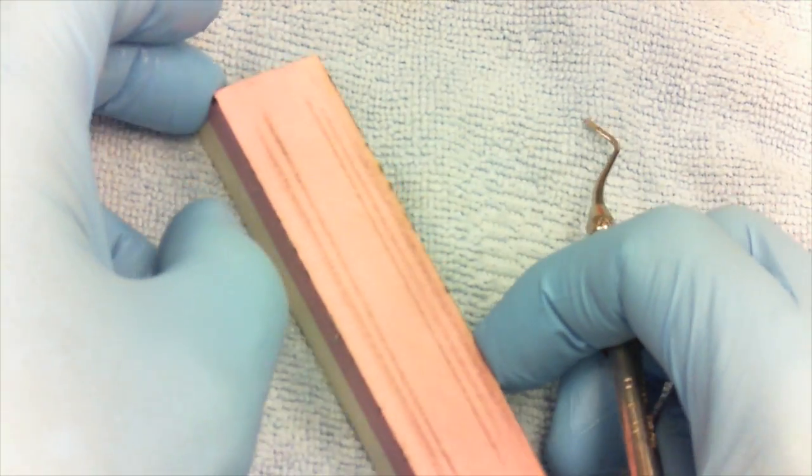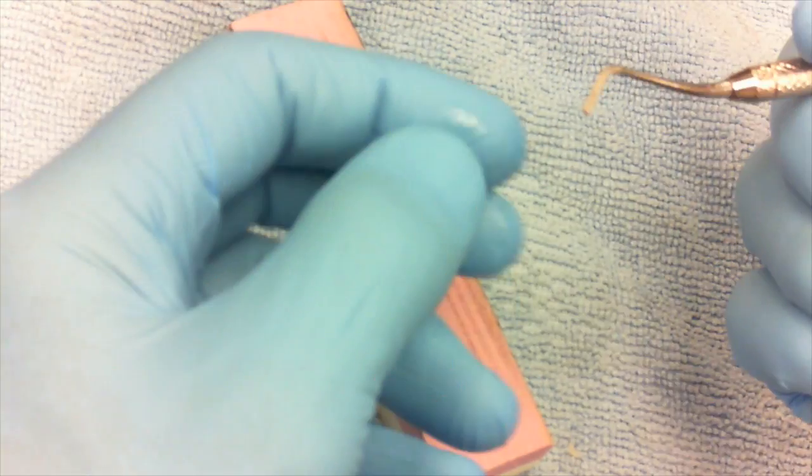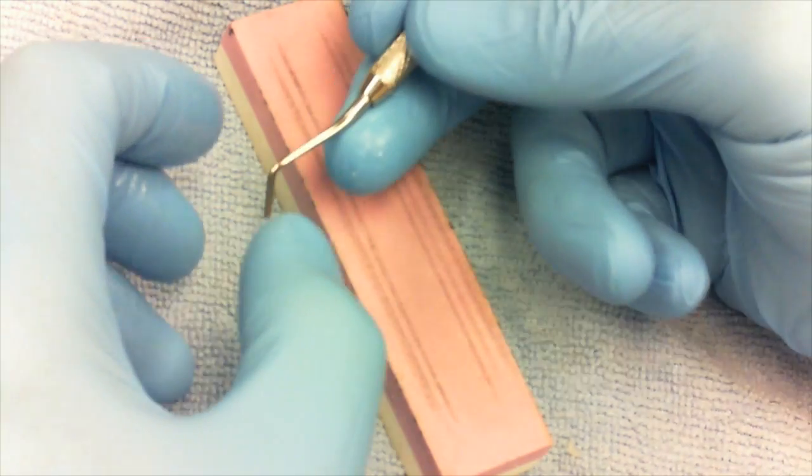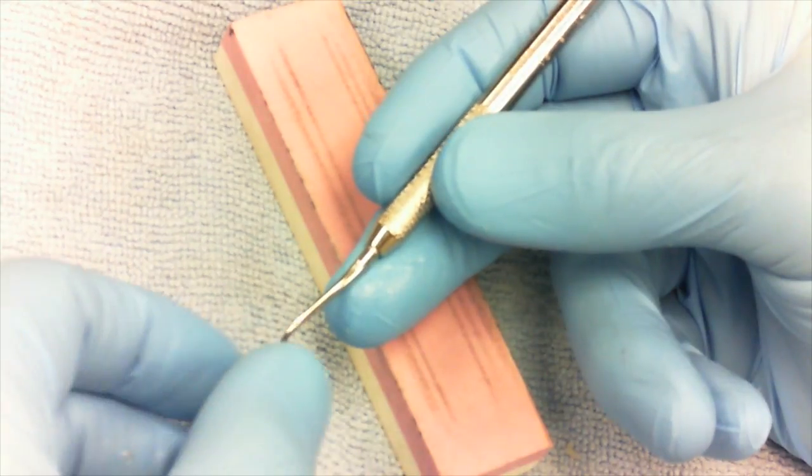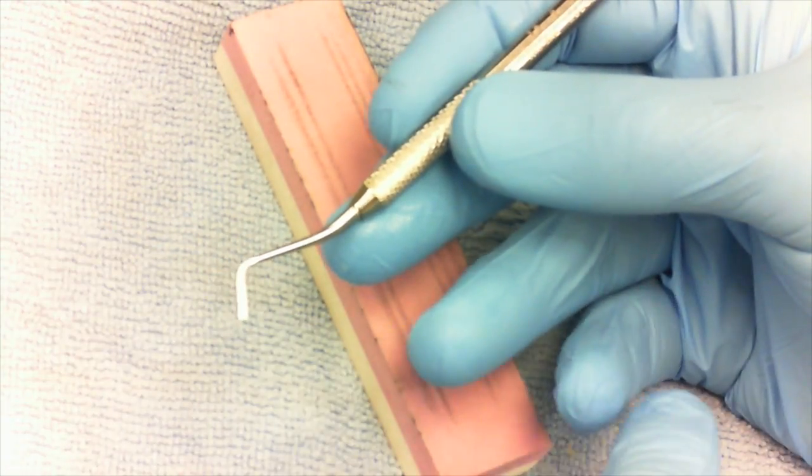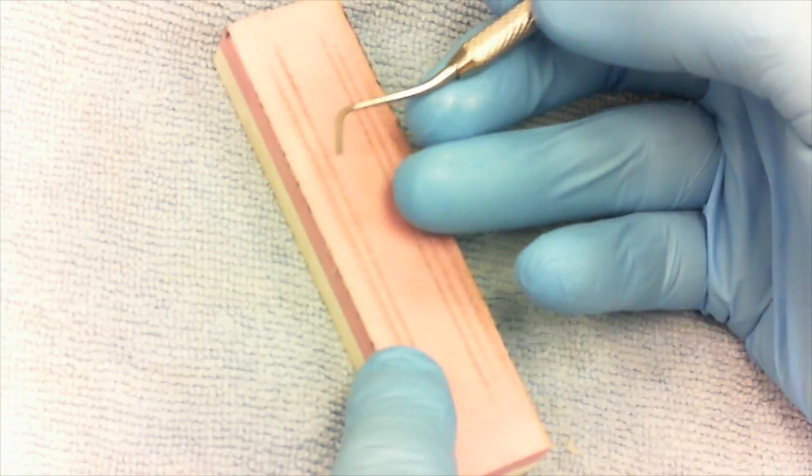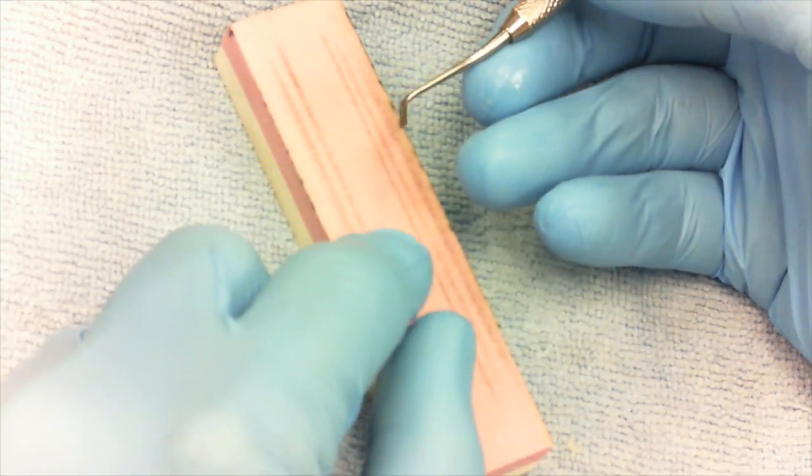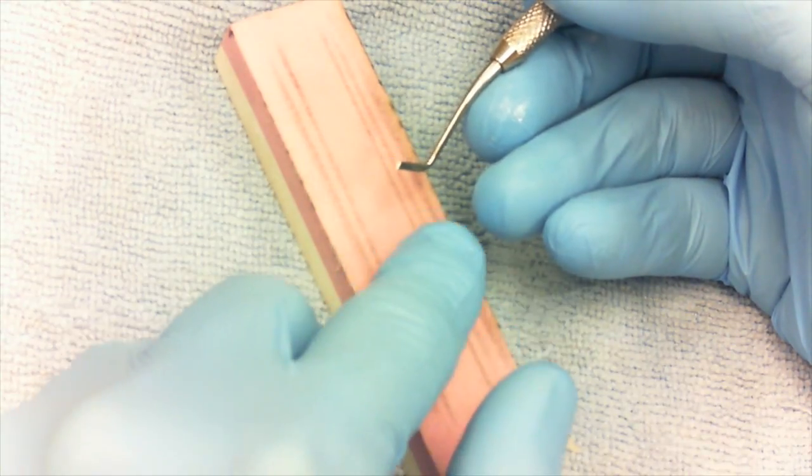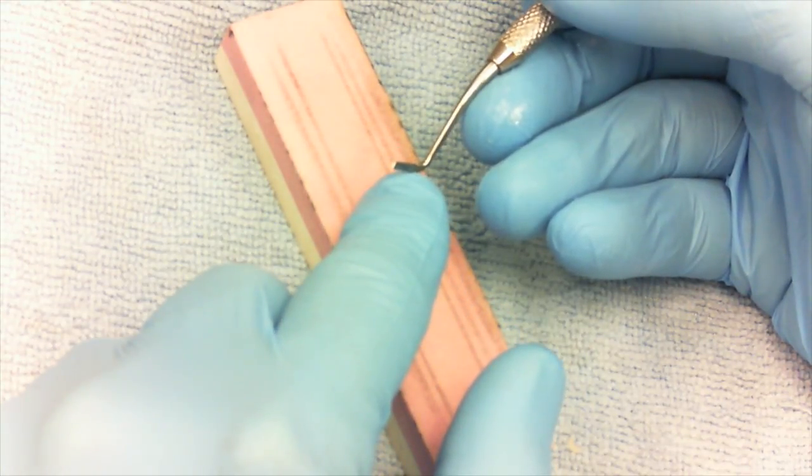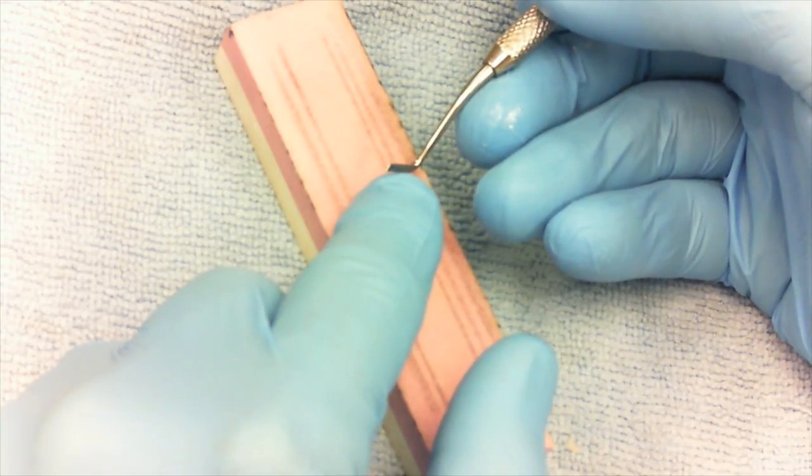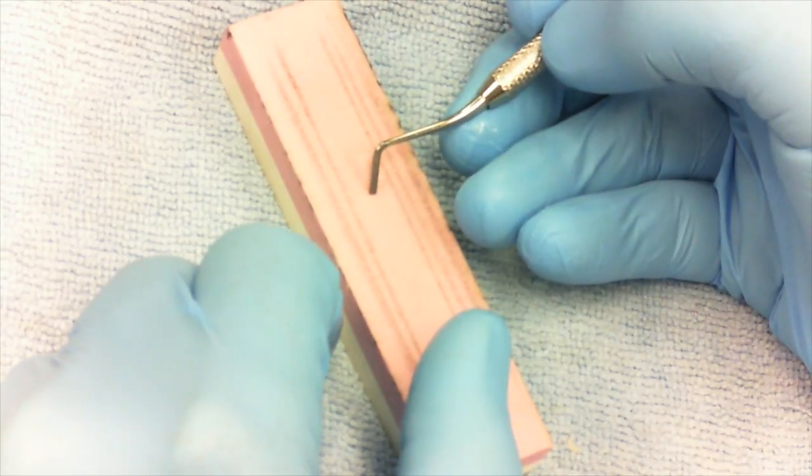Here's the goal when it comes to sharpening instruments. You want to always hold the instrument with a modified pen grasp. I'm going to use my ring finger and pinky to stabilize against the side of the sharpening stone. I want to also identify the bevel. The bevel is easy to see because it reflects light back and looks like a little parallelogram. That's going to be up against the stone.